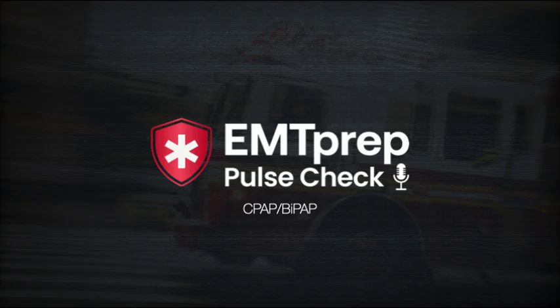Ideally, you want to use 2 people. One provider will maintain a mask seal while the other provider ventilates. You have the one-person method where you can do the CE technique, or a different technique, and we'll talk about that here shortly. We'll squeeze the BVM gently over 1 second, delivering an ideal tidal volume, like I said, anywhere from 6 to 7 or 6 to 8 milliliters per kilogram of ideal body weight, which comes out to approximately 500 milliliters. This should be just enough for a chest rise and fall. And we should consider checking for lung sounds as well as utilizing an end tidal CO2 filter line.